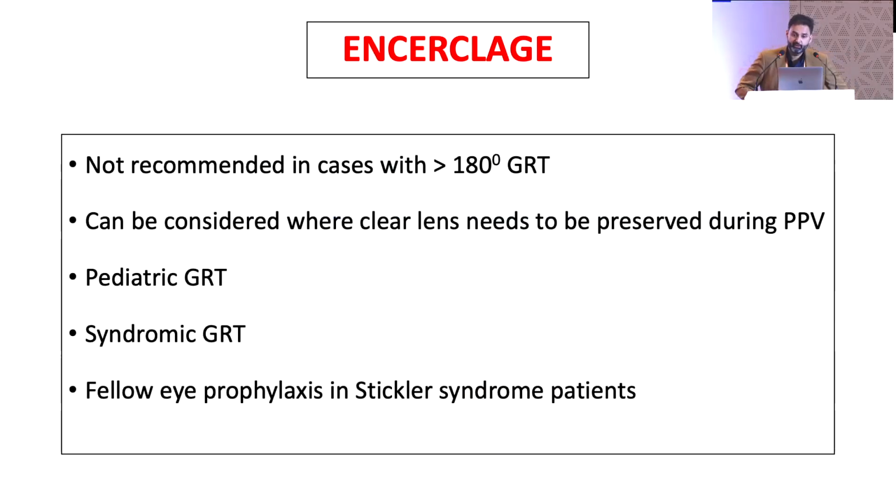As far as encirclage, it is typically not recommended in giant retinal tears greater than 180 degrees. It can be considered in patients where the lens is clear and you want to try and preserve it and not combine it with either lensectomy or cataract surgery. I definitely try and do it in pediatric and syndromic eyes if it's 180 degrees and lesser, and for fellow eyes in Stickler syndrome patients.